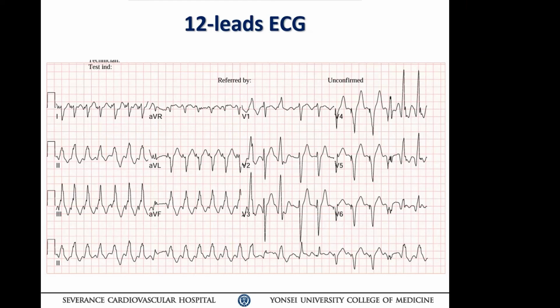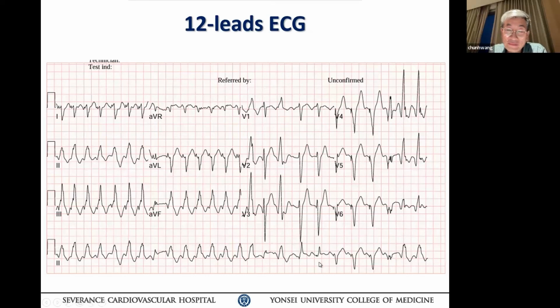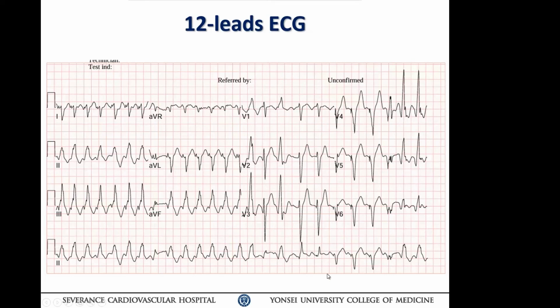Yeah, I think that one possibility is VT terminates transiently, or the sinus conducted P wave QRS is mixed, generating fusion or capture beats. Because in the later part of the rhythm strip, the P conducted QRS is not the paced rhythm. In the middle part, there's a little different shape of QRS morphology. So I guess if the sinus rhythm or atrial tachycardia takes over, the narrow QRS rhythm in between the wider QRS is one possibility. But it's one of the possibilities. So we need to exclude the potential aberrancy.